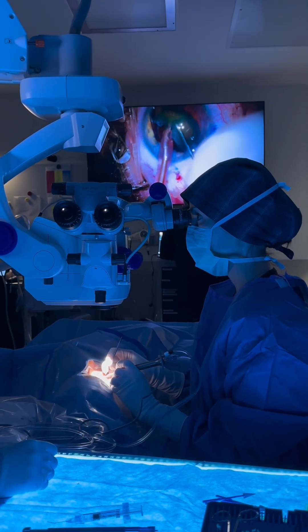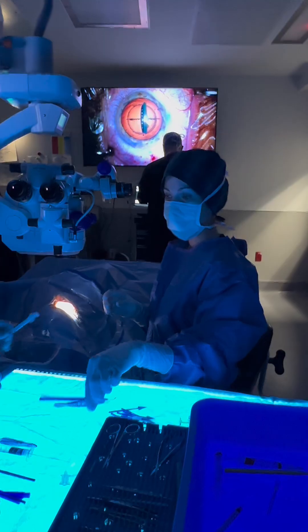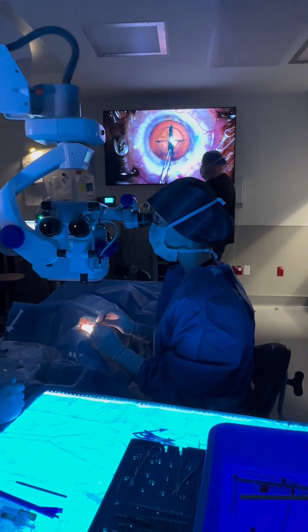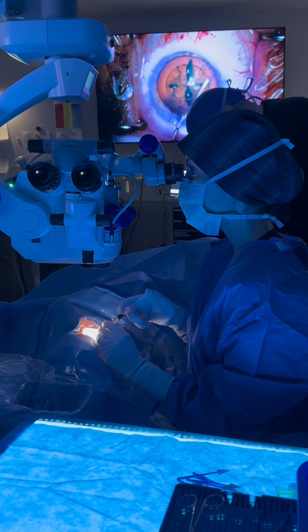This is a very intricate and beautiful surgery. A 2.4 millimeter incision — this is the opening that was made from the laser. Some irrigation which will separate the cataract from its shell.